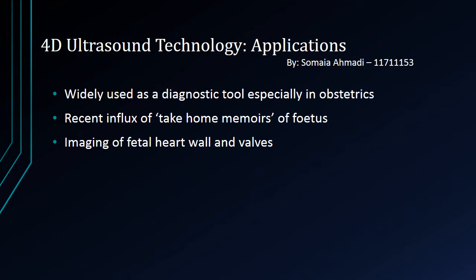4D ultrasound has been a recent innovation and has a niche application, which is the imaging of a fetus within the womb. This has been especially sought after by expecting parents who wish to view the unborn baby, and most natal clinics offer 4D ultrasound either as a diagnostic tool or as take-home memoirs of the unborn baby moving around. 4D ultrasound is also used in the diagnostic viewing of heart valves.